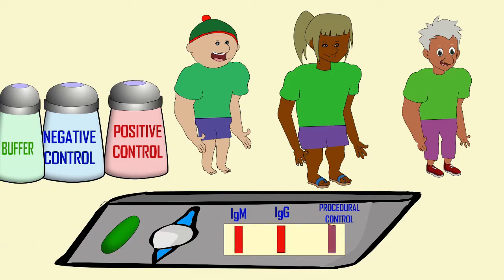If we see two red lines appear for IgM and IgG, this indicates that this patient has been exposed to coronavirus and is making both types of antibodies, which I'll explain in a second.